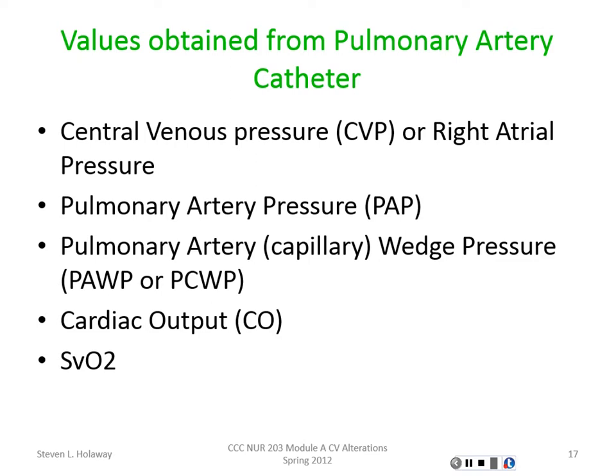Now, when I first started, we had to do a whole bunch of equations to do our cardiac output. I love the new computers. You just push it in, push the fluid, and it gives you your cardiac output. So that is the good thing. You can also measure SVO2. SVO2 really looks at how the body is using the oxygen. Is it using the oxygen that's out there properly, or do we need more oxygen? Again, I'm not going to get a lot into SVO2 because that really gets into big critical care, but just know you can measure that.